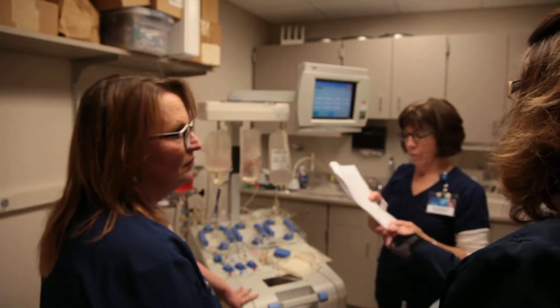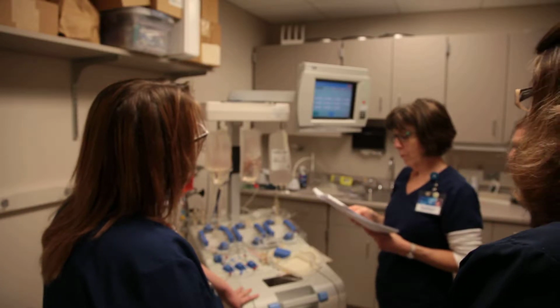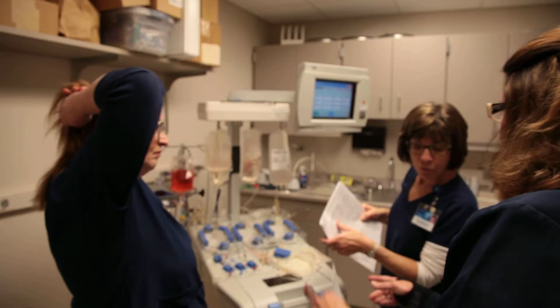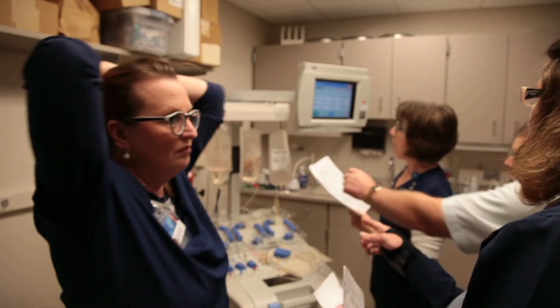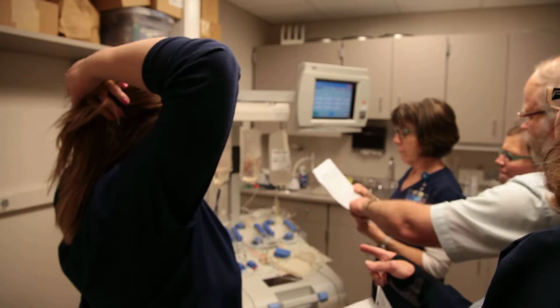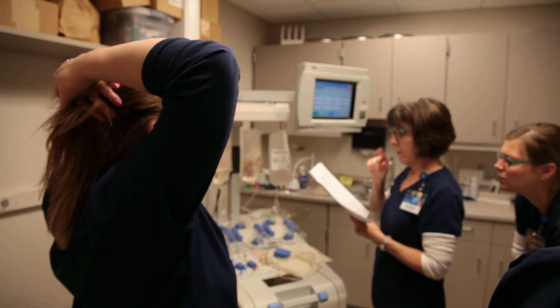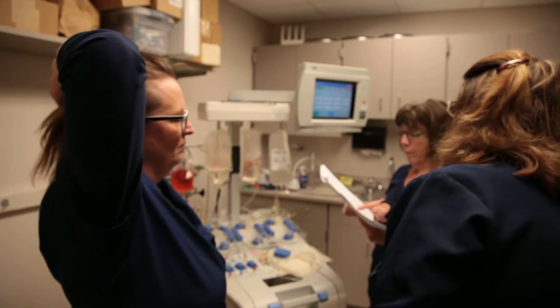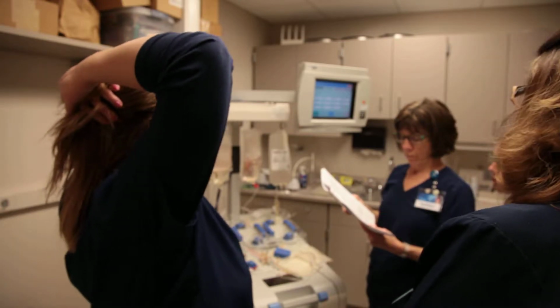And then, according to our SOP, we need to follow along for the size child that we are doing. We are 13 kilograms. So if you're going to be doing a blood prime, you're going to be in this column, because it's less than 17. Anything over 17.3, you don't have to do a blood prime. That's for the research, only animals.